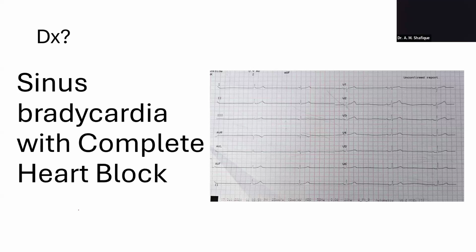Sir, I think it could be both, because sinus node disease itself is confined to that. If sinus node disease is causing the bradycardia, then we should not see complete heart block, because the patient probably has both sinus node and AV nodal disease. Right, sir, true. Otherwise, why would you see complete heart block? So there is no evidence of AV nodal conduction, right? Right, sir.